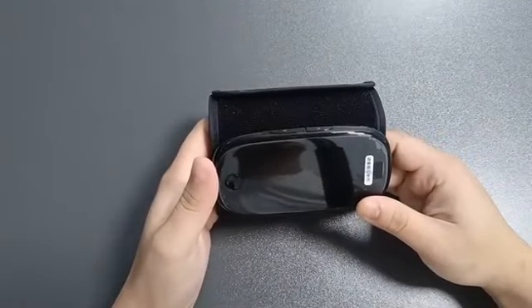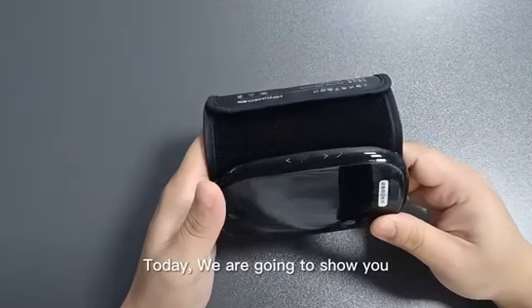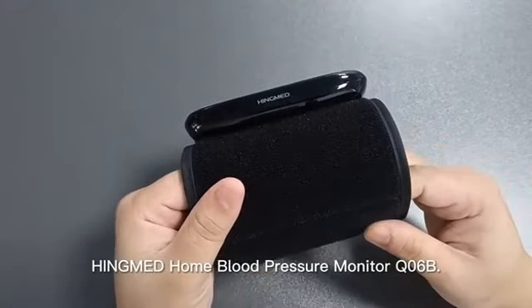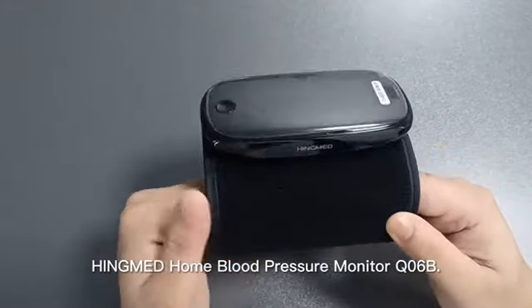Hello everyone. Today, we are going to show you how to measure your blood pressure at home using the HingMed Home Blood Pressure Monitor Q06B.